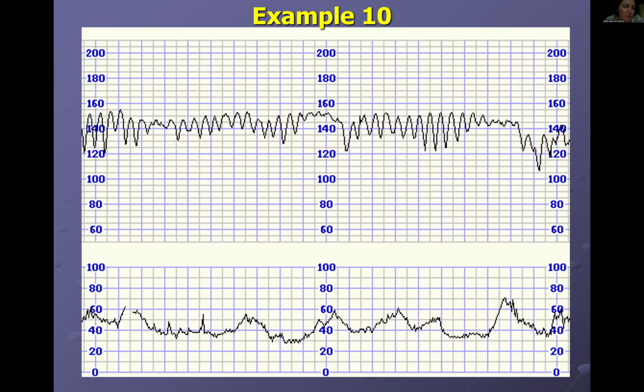But again, if you use DR C BRAVADO, so the term risk, she's high risk. There was meconium, and she's also 41 years old. And the contractions, there are contractions, right? About 1, 2, 3, 4, about 4. And the baseline rate, you can't really say where the baseline rate is because this is a sinusoidal pattern. Of course, there are no accelerations.